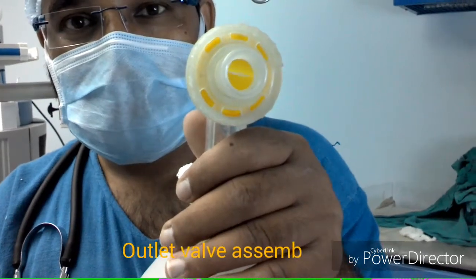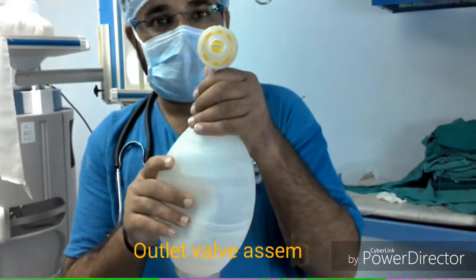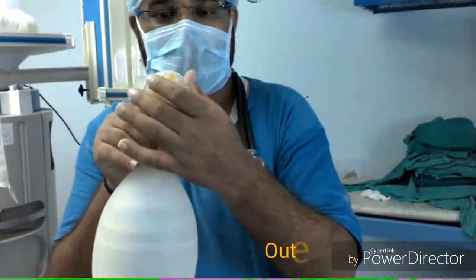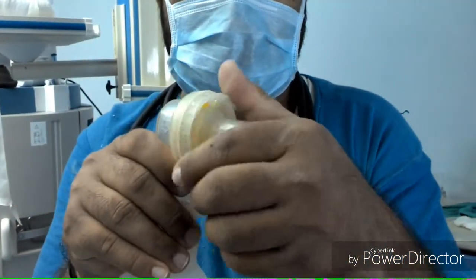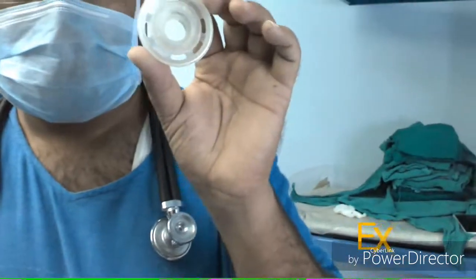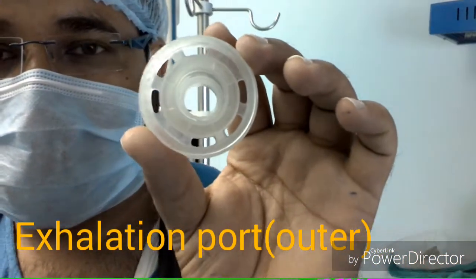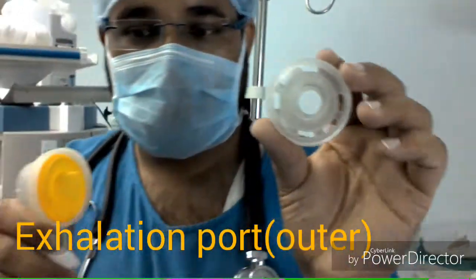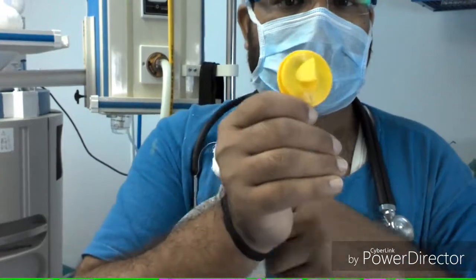Outlet valve assembly has two valves in one. Central is the fish mouth valve and peripheral is the diaphragm valve. Fish mouth valve opens during bag compression or inspiration and closes during expiration. Peripheral diaphragm closes expiratory ports during inspiration and opens them during expiration.